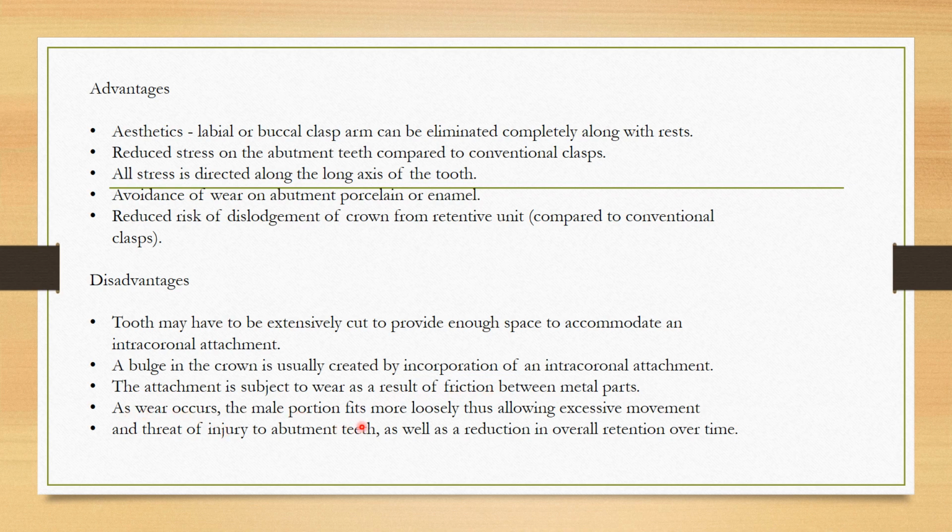As wear occurs, the male portion fits more loosely, thus allowing excessive movement. Hence, this may lead to injury to the abutment teeth and will reduce the retention over time. So these are certain disadvantages. We can decide and assess the case, and only if indicated it can be done. Not in all cases does a precision attachment or any type of attachment give a successful result, so it has to be properly assessed.